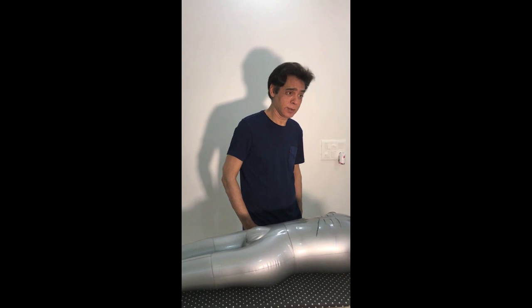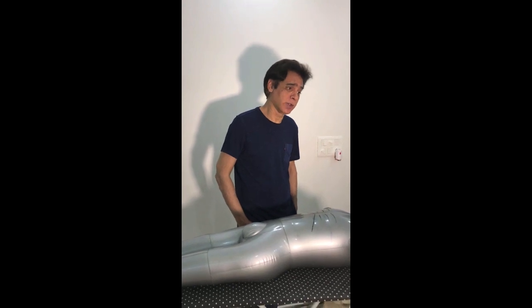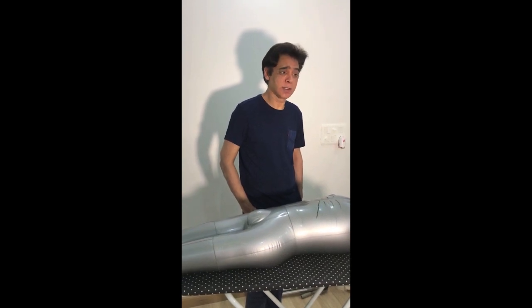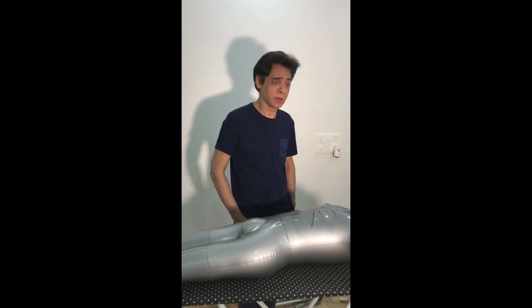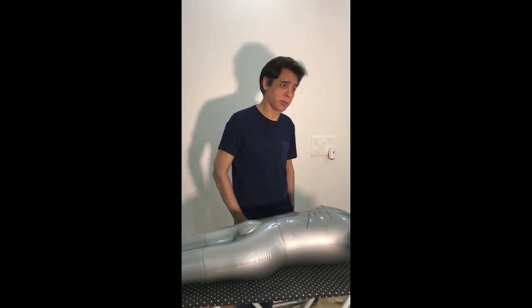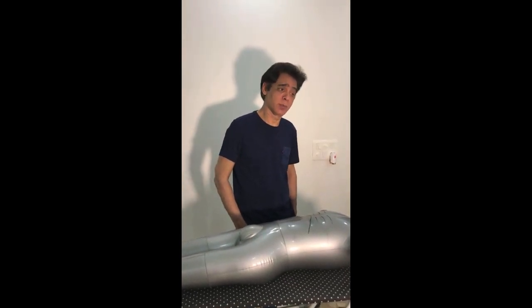The reason is, if you write such a report, then the person has to go for other investigations, because the person has to find out what is there in the distal part. Majority of the problems, whether it is a stone or any mass which is pressing on the common bile duct, tend to occur more in the distal part compared to the proximal part. So, giving a proper report on the distal part is very important.